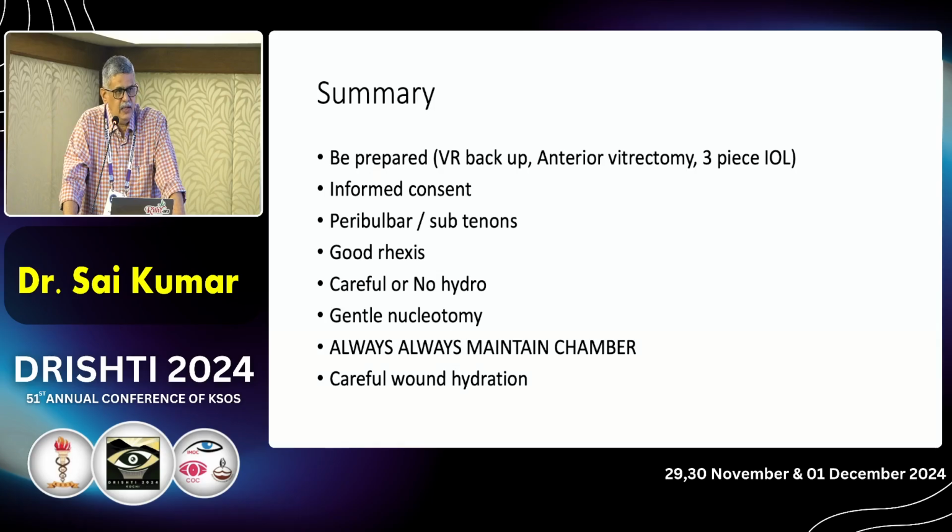Always, always maintain the anterior chamber. This is one thing that always has to be in mind. It is something that we have to practice in every phaco, not only in PPCs, but especially so in posterior polar cataracts. Never let the chamber shallow. The moment the chamber shallows, the thin capsule just gives way. So always remember that. And even for the last wound hydration, don't take off your vigil from the eye.